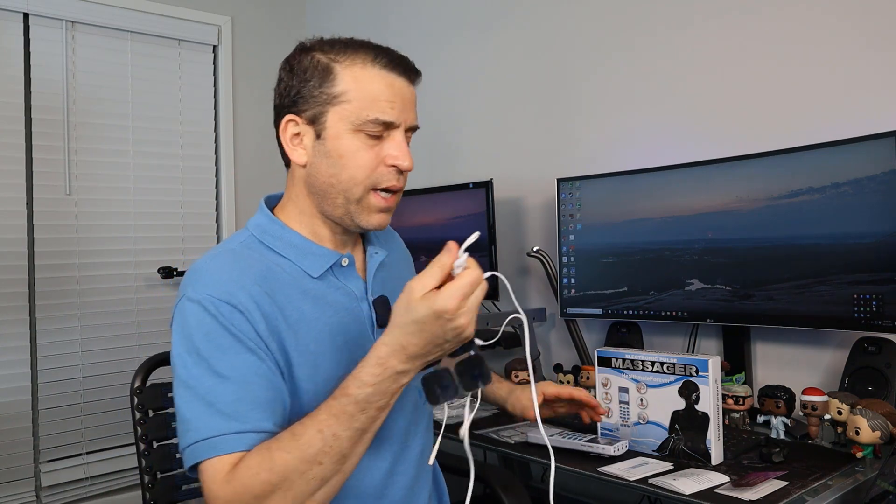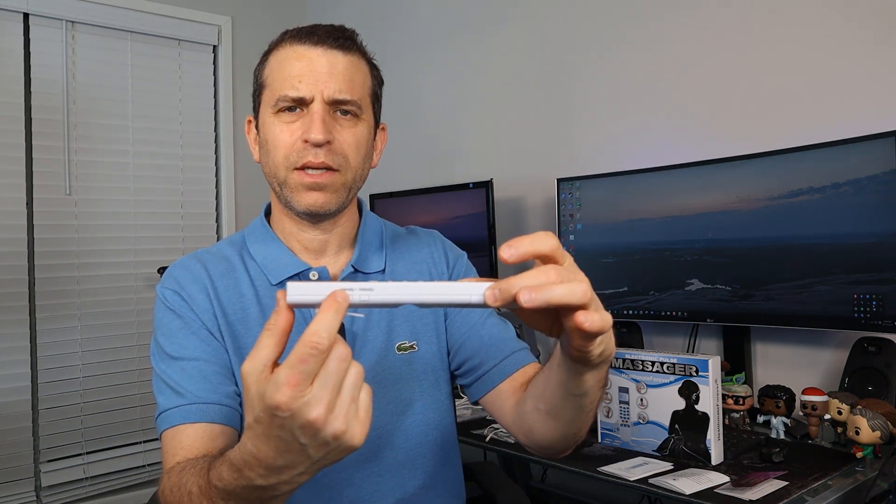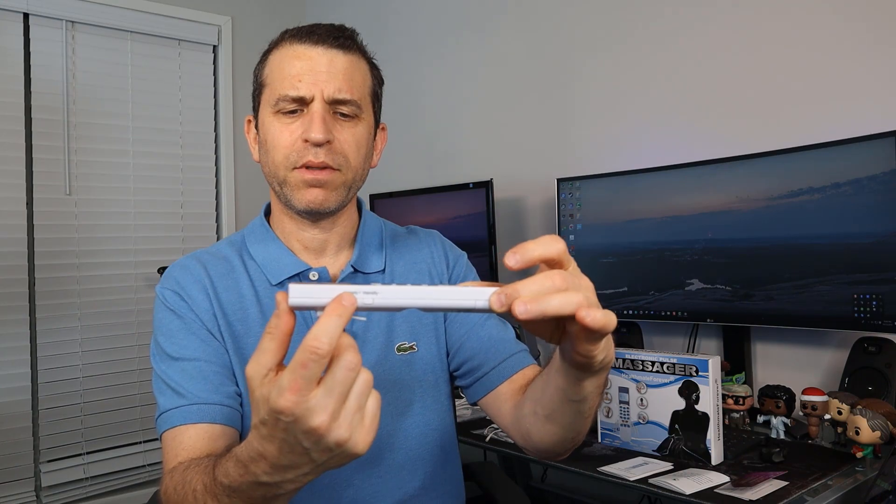So at the top you've got A1 and A2, B1 and B2. A1 and A2 are controlled by the intensity level on this side — intensity up and intensity down. B1 and B2 are controlled by the other side. This means you can have one part of your body feeling more intensity than the other. You also have your power button, and when you turn it on there's a nice display.